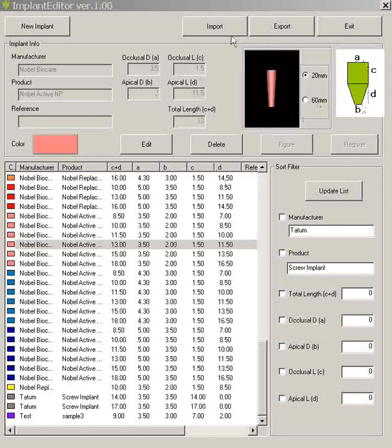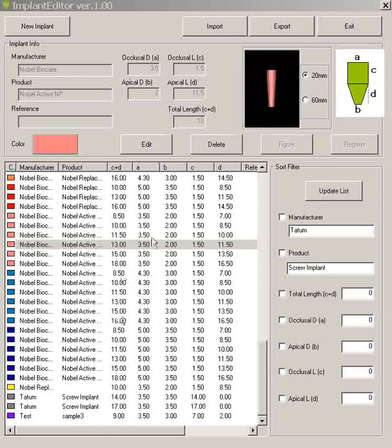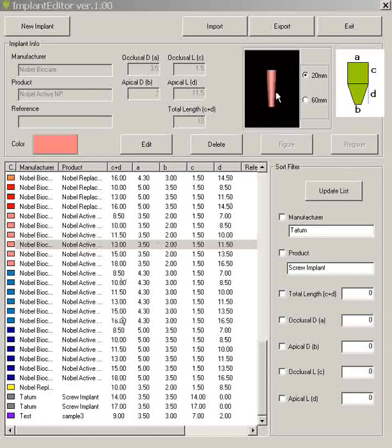Now even though you have an import icon, if your particular manufacturers send you the implants in XML format, then we can just simply import those to the library. But Discovery has shown that it's not the case. That your implant manufacturers will not send you the library in XML type format. So you just have to create it.